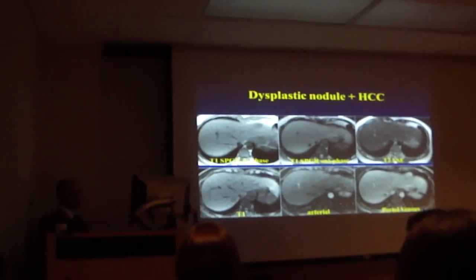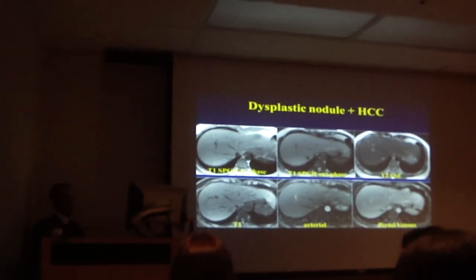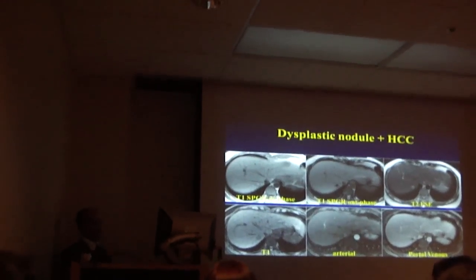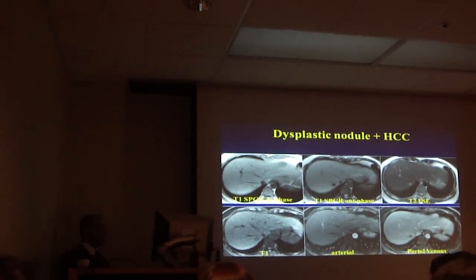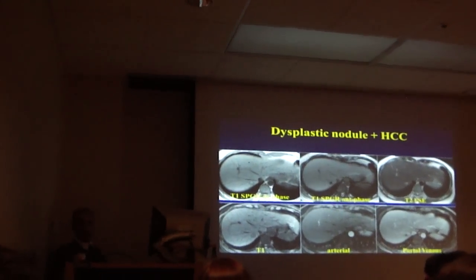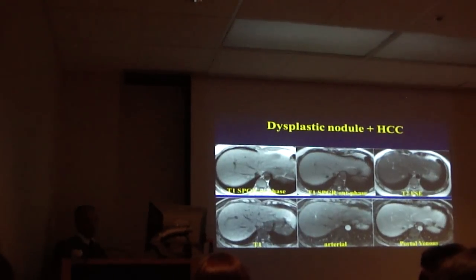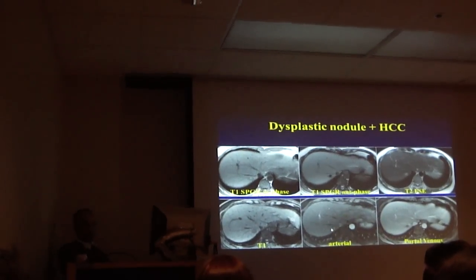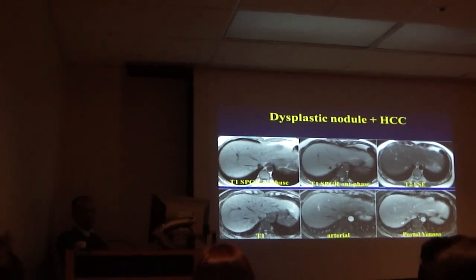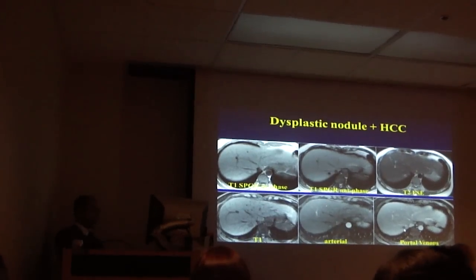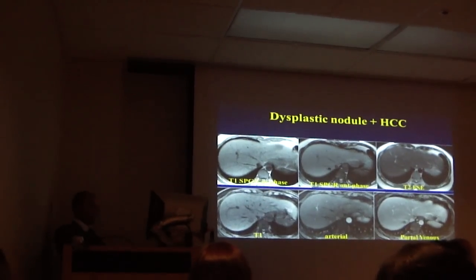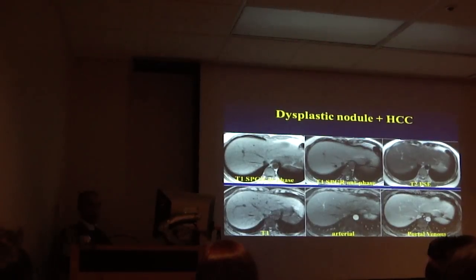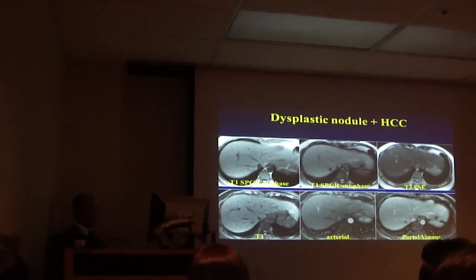Just based on images, we said this is a dysplastic nodule with an HCC in it. He asked why, and I said it demonstrates washout. And why is it a dysplastic nodule with HCC? Because not all of it demonstrates enhancement — this part does not — and not all of it demonstrates washout. So there are two entities here. He went in and took it out, and it actually was dysplastic nodule with HCC.